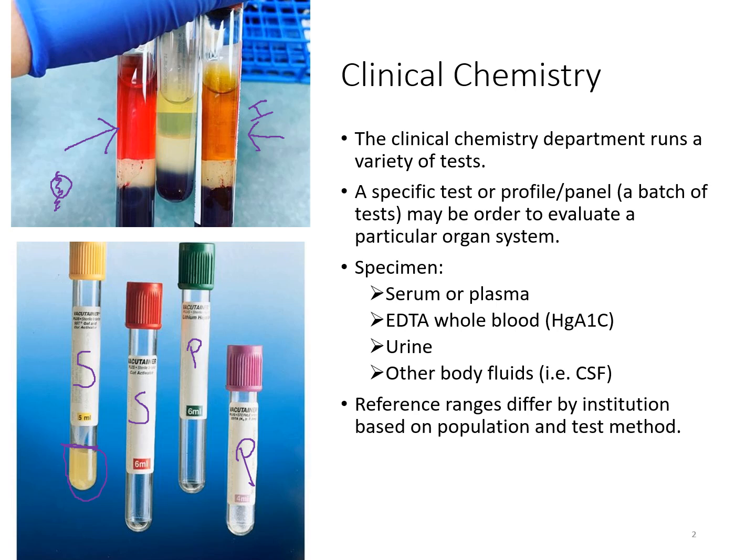With an icteric sample, it's usually bilirubin that causes this golden color here. Depending on the test method that you're using and the particular test, this bilirubin can interfere, as well as the cherry red color from the hemoglobin, as well as the contents inside that red cell, particularly potassium, which can cause an increase in potassium when it leaches out of those cells.